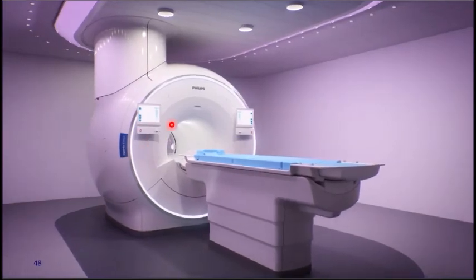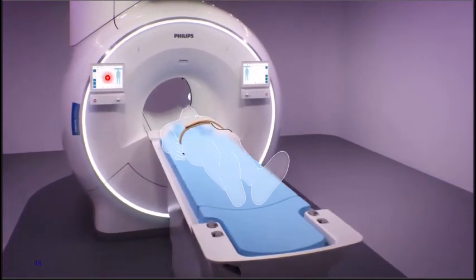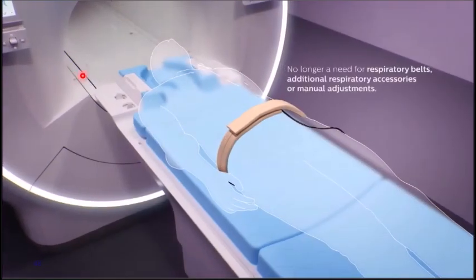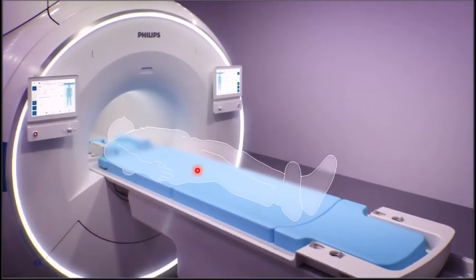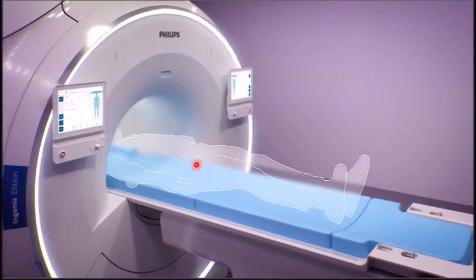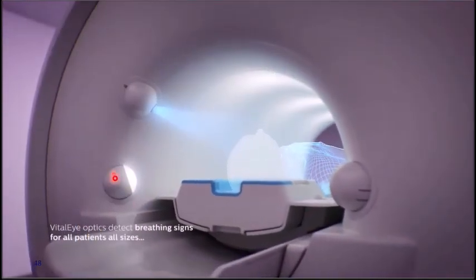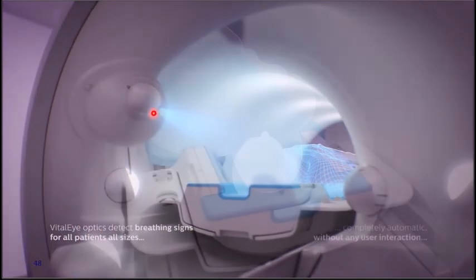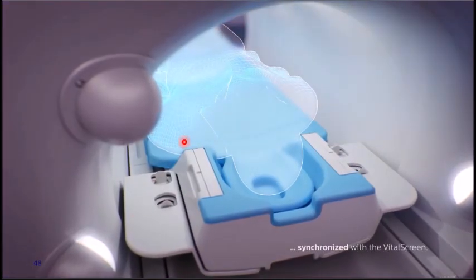Here is the front screen where the caregivers or clinicians can see the respiratory signal. In the previous setting, they used the respiratory belt. Now they don't need to use that. And here is the VitalEye setting. This is the VitalEye camera, and this is the ball light providing the illumination.